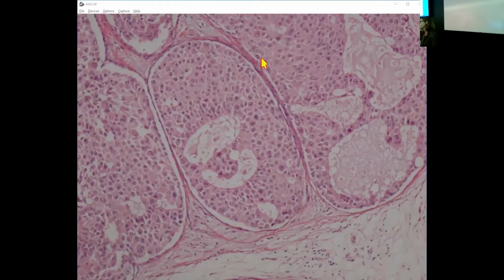Apocrine lesions are really hard actually, because you need that three to fourfold variation in nucleus size to get to atypical. So again I rely on architecture. That's for the lower end of the spectrum, lower grade lesions, because in high grade lesions it's easy, right? You can make a diagnosis of DCIS.